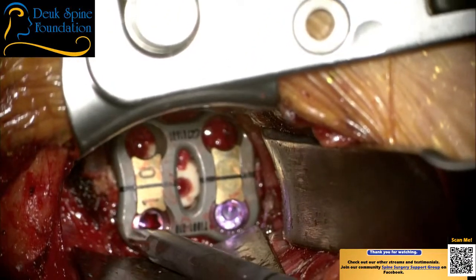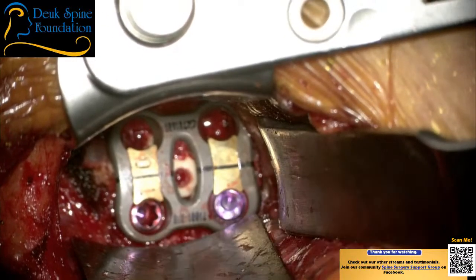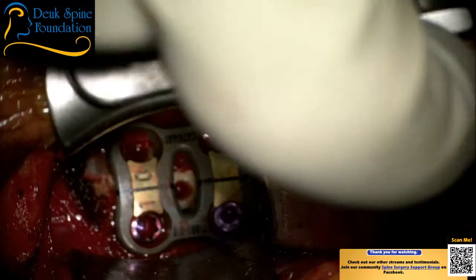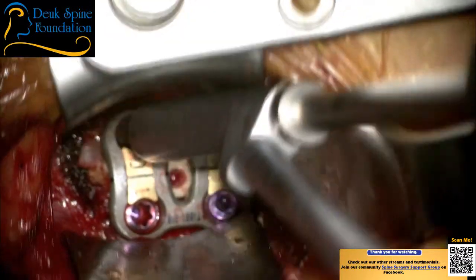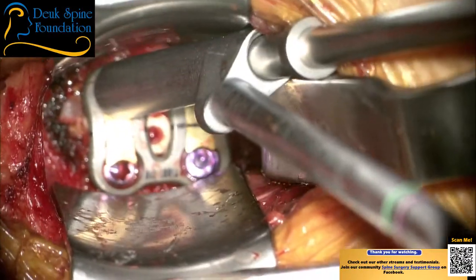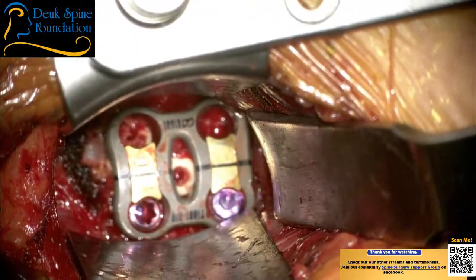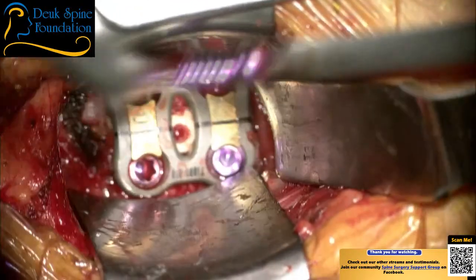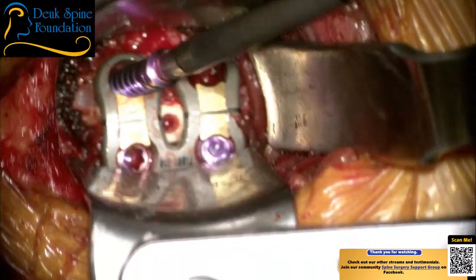Actually screwing these screws into the bone, folks, into the C6 and C7 vertebrae. So that's called fixation, internal fixation. Okay, good, perfect. And again, I'm aiming up for the screws at the top, and I'm aiming down for the screws at the bottom.